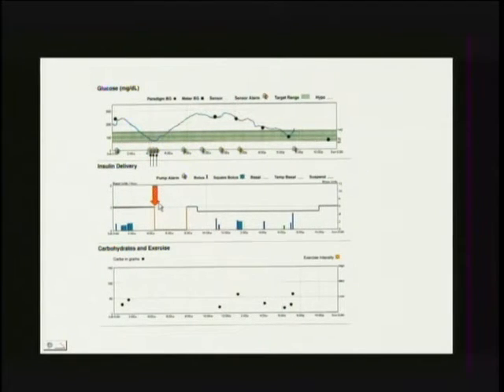And you can see, instead of going downstairs to get something to eat, she turns off her pump to 0. She's now getting no insulin. She goes back to sleep. And what happens? The alarm goes off when she goes above 200. And what does she do? She turns her pump back on. She doesn't bolus any insulin. She just turns her pump back on, and she goes back to sleep. After the alarm goes off, there she turns her pump on. The alarm goes off again, and now she wakes up.